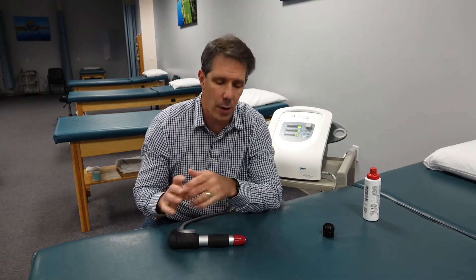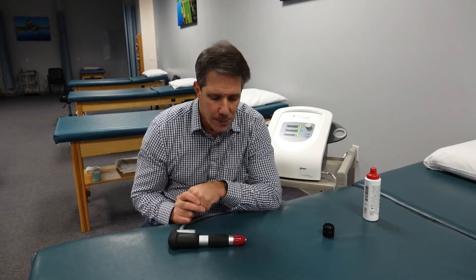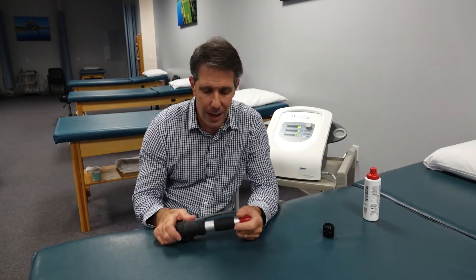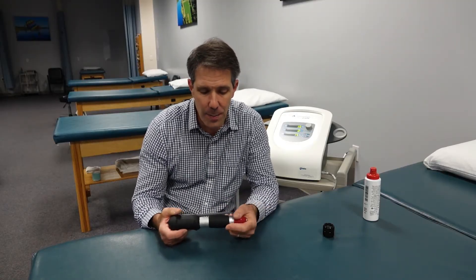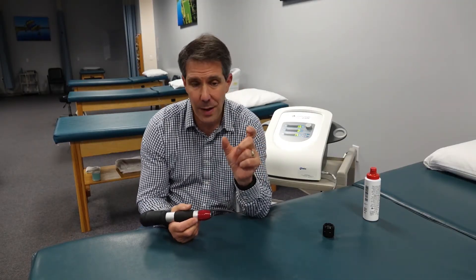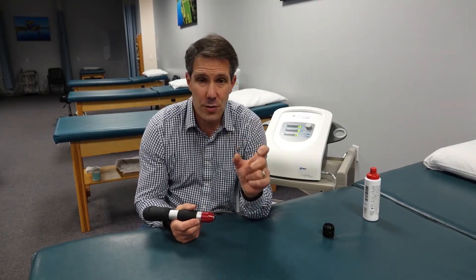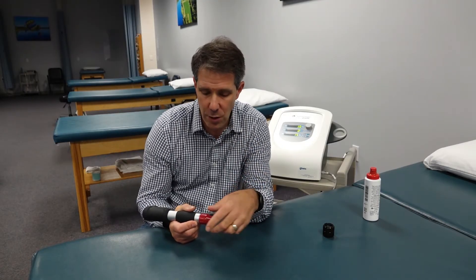Chronic tendinopathy type issues like plantar fasciopathy and Achilles tendinopathy work really well with it, as does patellar tendinopathy. It's a modality like any other — it has its limitations but also its benefits. One of the benefits is that the acoustic wave can penetrate about two inches deep, so you can really get those deep structures very well.